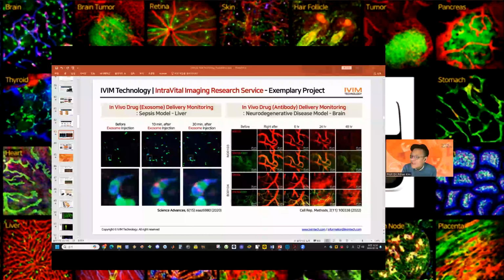We can repeat this lung imaging in the same mouse model. And then we can image 4 cell types because we have a 4 color detector. So we can simultaneously detect 4 fluorescent colors, so we can see 4 different cell types at the same time.